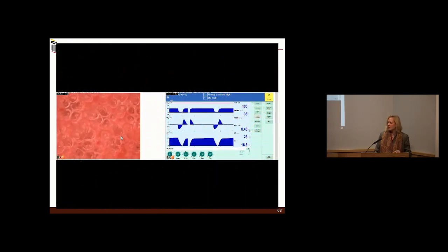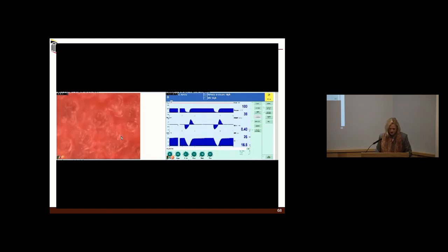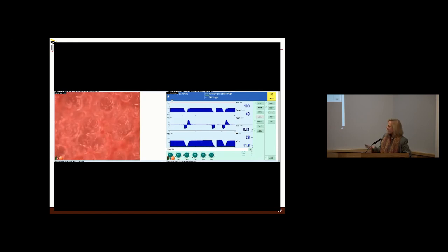So here are just the videos. This is at 10%, and you can see the difference in the CPAP to release, a lot of loss in lung volume. And now here, this is 50%, okay? And do you see what I mean here by that? There's my cross, right? That's 50%. So do you see how the termination is at the halfway point of your expiratory flow?